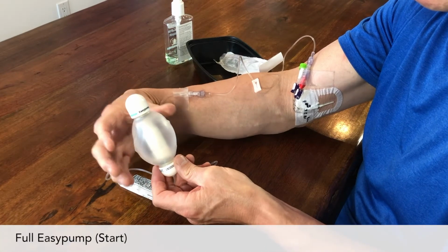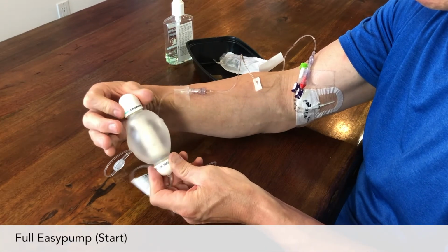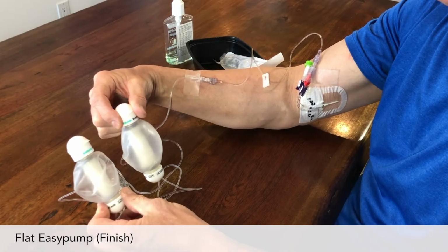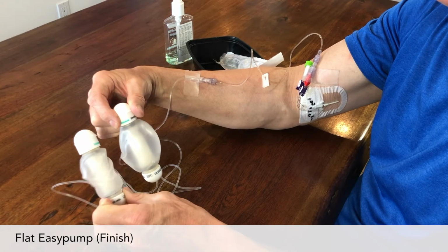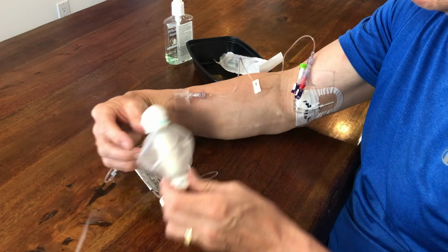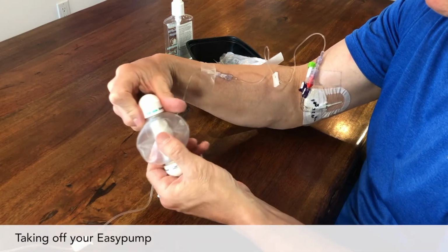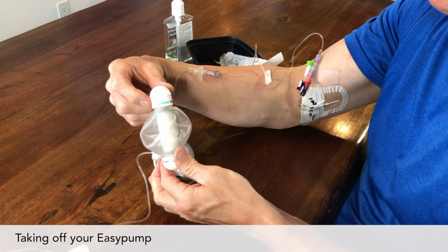This is what a full pump looks like at the start. The balloon will be deflated or flat when the pump is empty. You know you've received all of your medicine when the pump balloon is flat. You can feel the hard inner core of the pump. Now you need to take the tubing off of your IV.